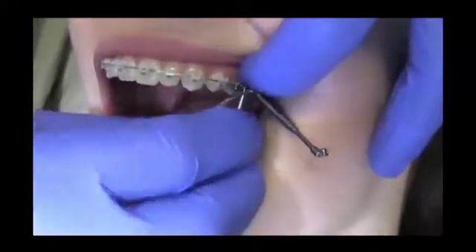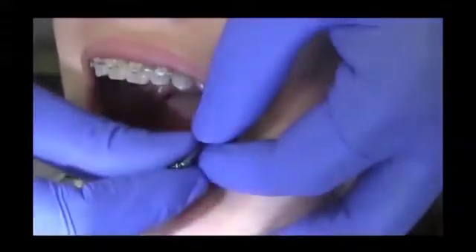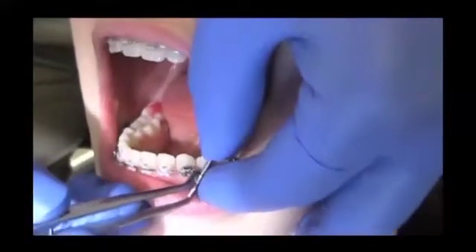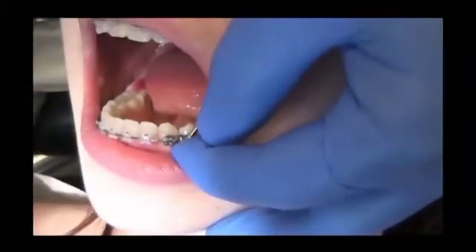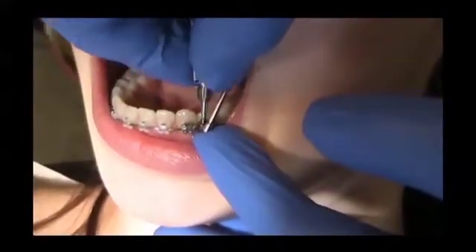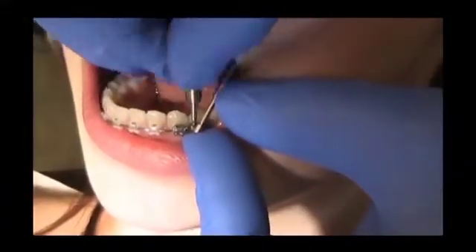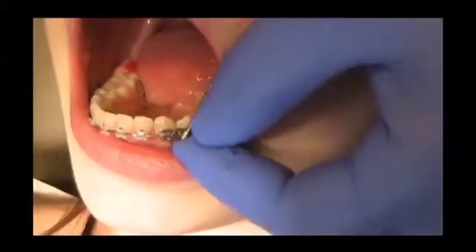The connecting element must not have any contact to the bracket on the first molar. After fixing the maxillary connecting element, the mandibular connecting element must be attached between the canine and the first premolar. Slide the screw body onto the arch wire from gingival to occlusal and then attach the fixing screw. The connecting element should be placed as distal as possible, mesial to the bracket on the first premolar. The connecting element must not have any contact to the canine bracket at all.